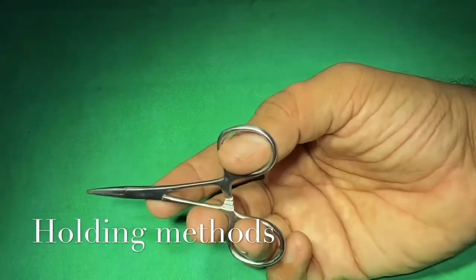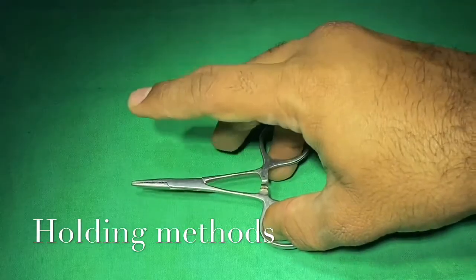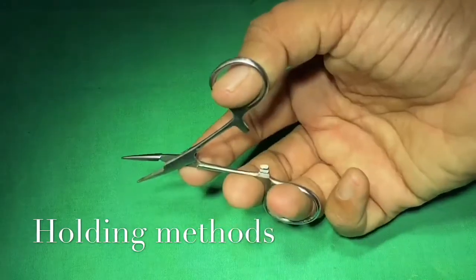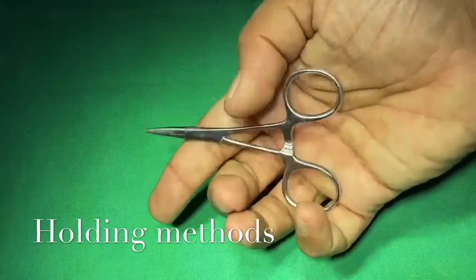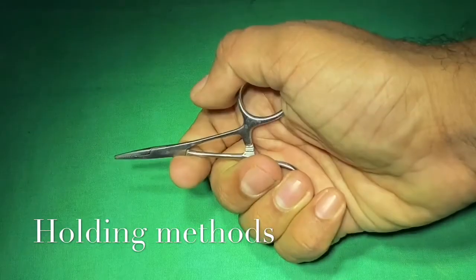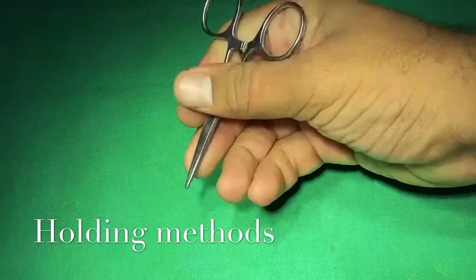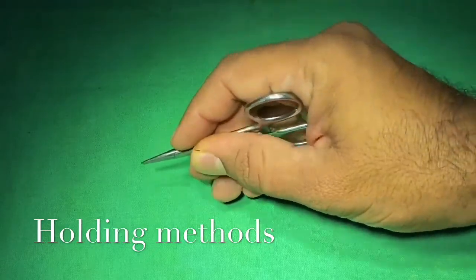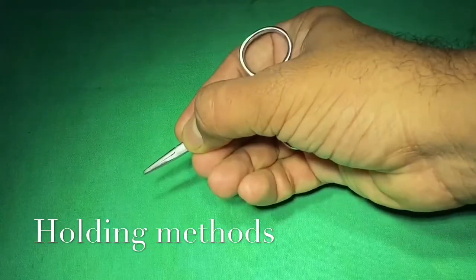There are different methods of holding an instrument. The tripod grip uses three fingers: thumb and ring fingers hold the instrument while the index finger supports and guides it. The palmar grip is used where more force is required. The pencil grip is used when operating on fine surgeries.